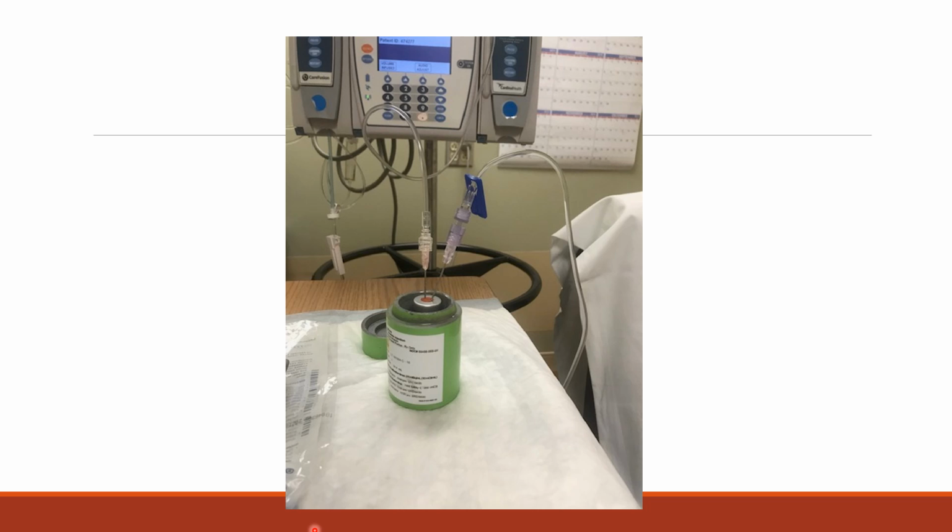One, if this pressure gets unequalized in here, then it's going to spit out these needles and you could get a spill of Lutathera. If the IV is not working, then the pressure builds up in the vial. The saline will continue to drop in there. The pressure will build up and it will push the needles out. So you want to make sure that they have a good IV.